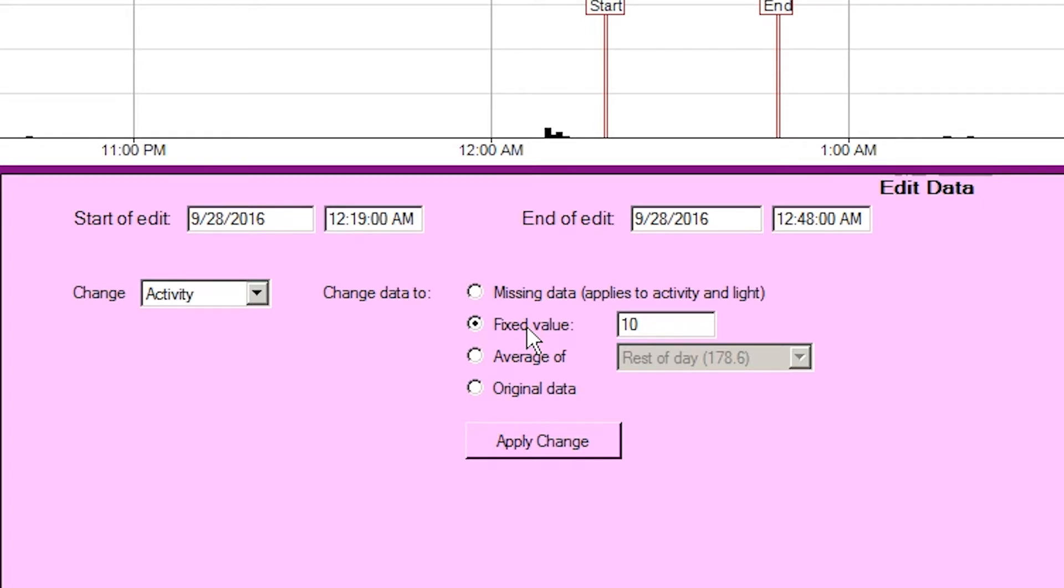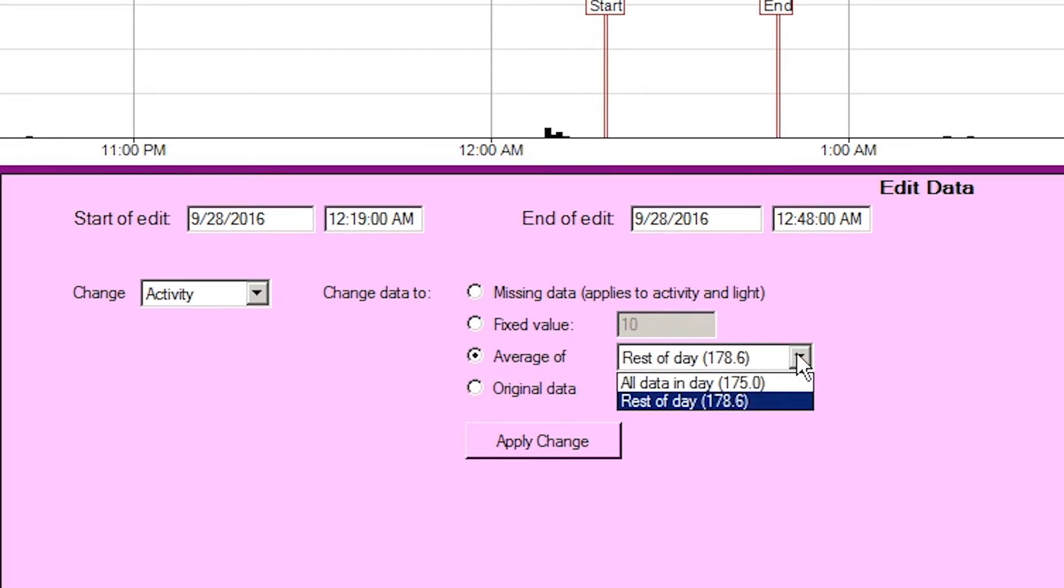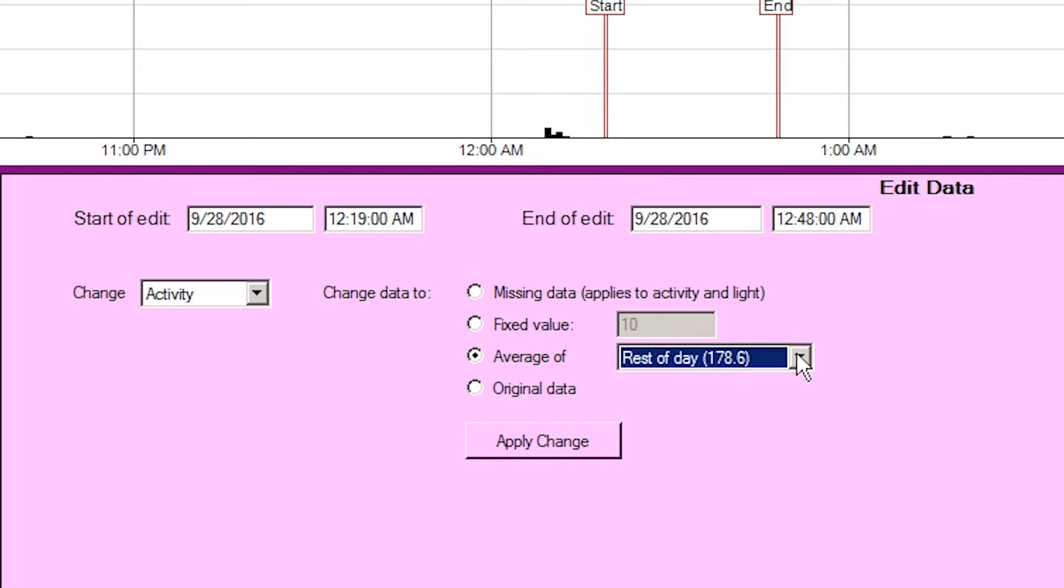Average of, this will set the data samples to either the average of the entire day including the selected period or the average of the day excluding the selected period. The day is taken as the 24-hour period between midnights which contains the start time of the edit.